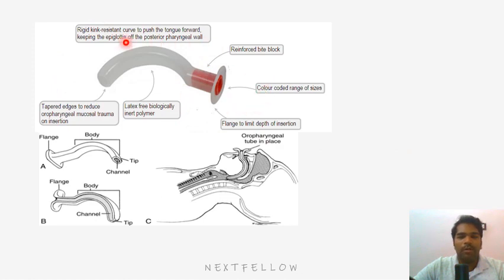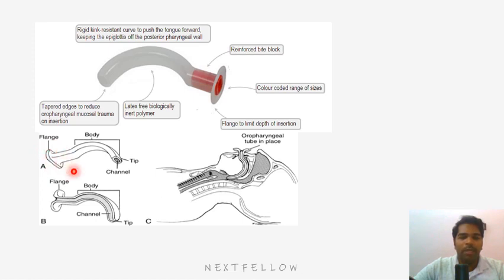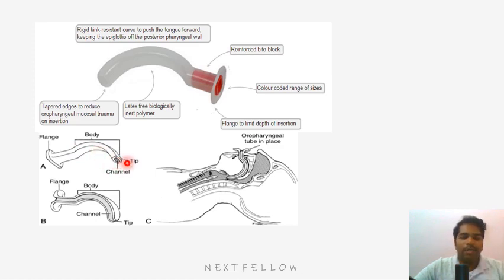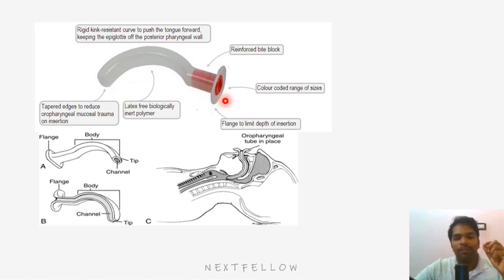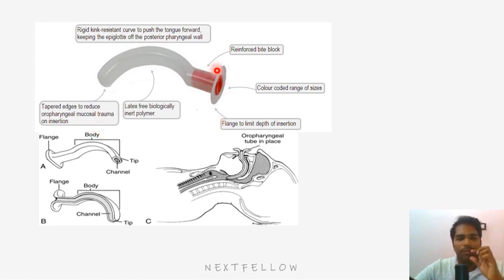The classic oropharyngeal airway is called Guedel's airway. It has several parts: the flange — the rectangular plastic portion that prevents the airway from slipping into the mouth by resting between the teeth; the body — a curved portion whose surface contacts the tongue; and the tip, which is placed in the pharynx and has a channel opening through which air can pass.